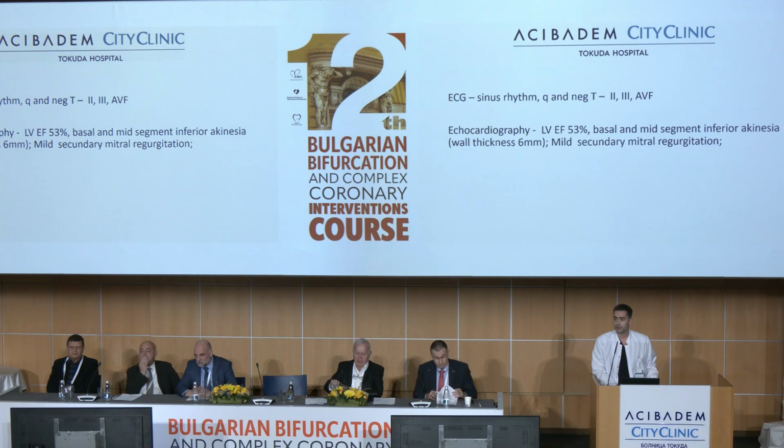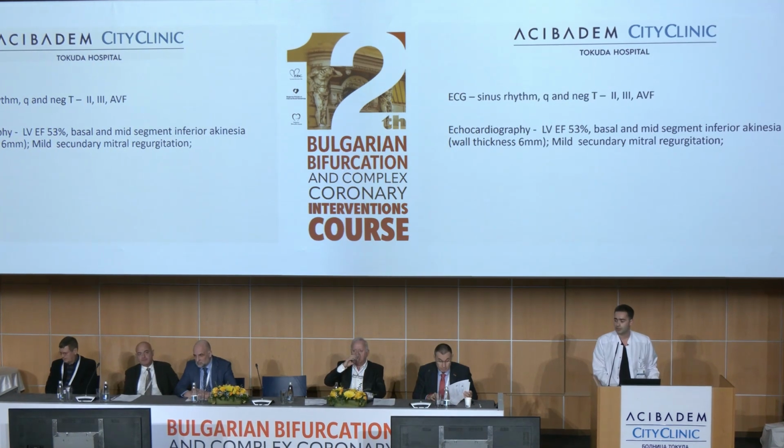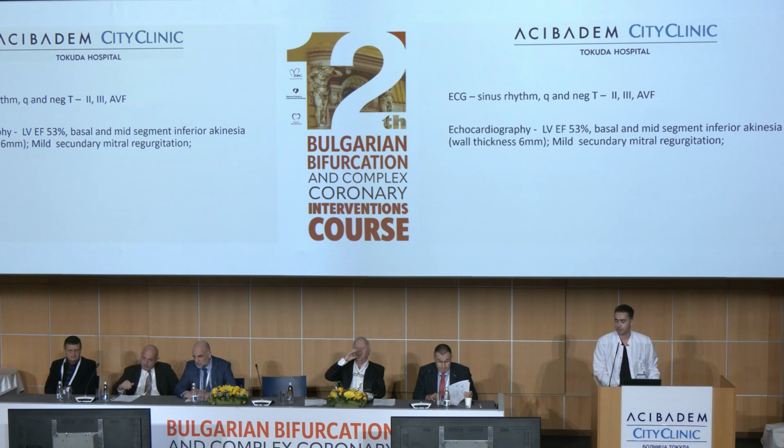From the echo, preserved left ventricular function with an ejection fraction of about 53, with basal and mid-segment inferior akinesia. The wall thickness is 6 millimeters. No severe regurgitation.